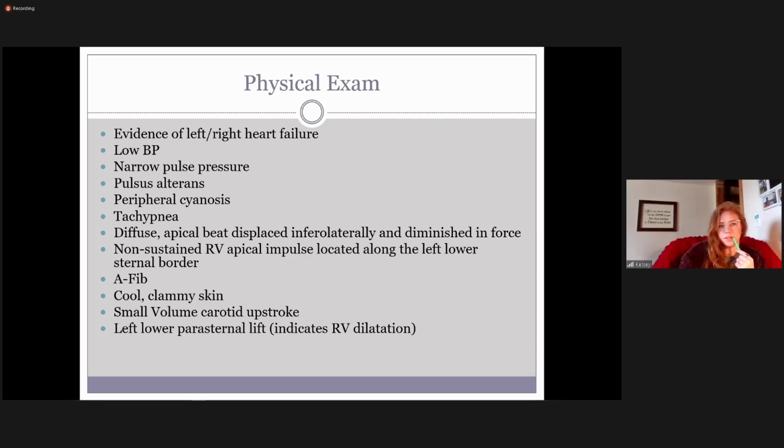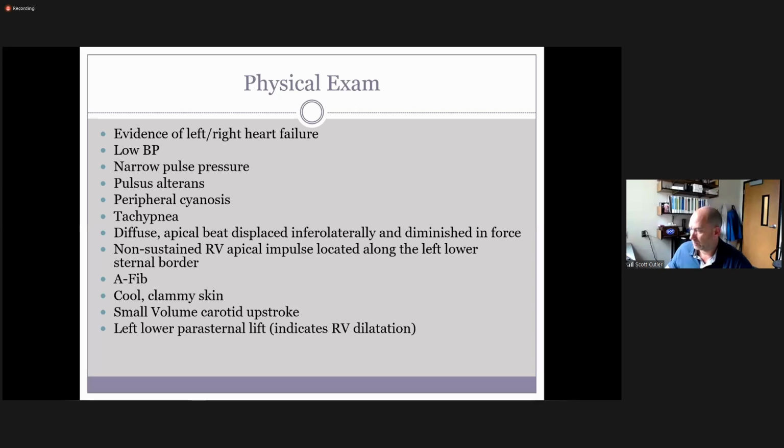Like systolic dysfunction and diastolic dysfunction? Yes, both. As we start to progress in this, and this is why, like I say, systolic function and diastolic function are really the bread and butter of echo. Every major anomaly that happens comes back to those two things, and really the viability or the strength of the heart is indicated by those two types of function. And that would eventually affect both.